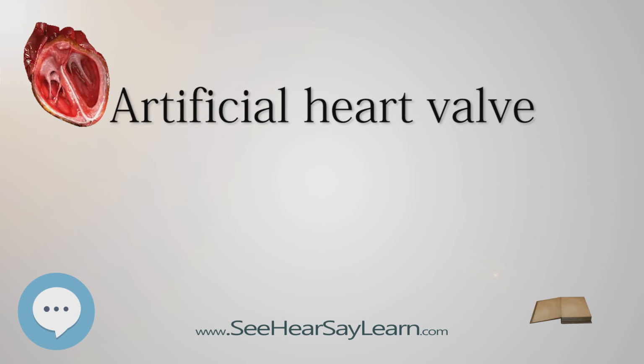Several causes of cavitation relating to valve closure have been identified. Squeeze flow is cavitation that is said to occur as the occluder approaches the housing during closure and fluid is squeezed between the occluder and the valve housing, causing a low pressure formation. Water hammer is cavitation caused by the sudden stop of the valve occluder as it contacts the valve housing.